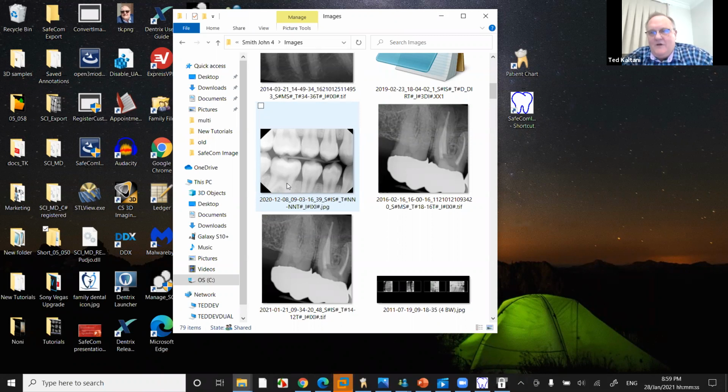So after you bring them out, you have to import them into the other software. Then you have to re-enter the tooth number and the date and time. So if you got thousands of images, in some cases you may have 200,000 images because you've used the software for 20 years, then it's not that it's impossible, but it's just not realistic. Let's put it this way.